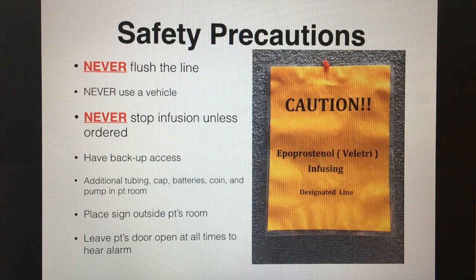If these medications are infusing peripherally, you have to have backup access. In case you lose the line or it infiltrates whatever for any reason, you need to make sure you have another access that you can switch over to as soon as possible.